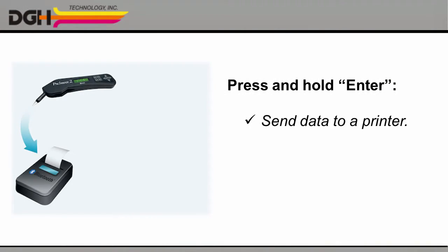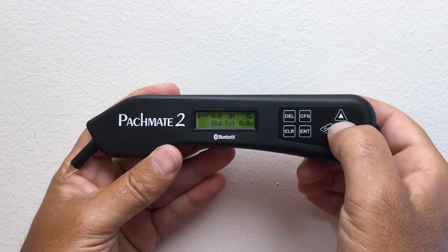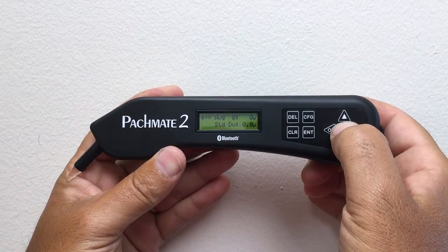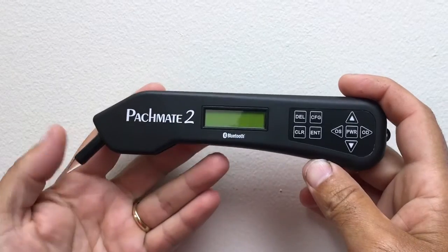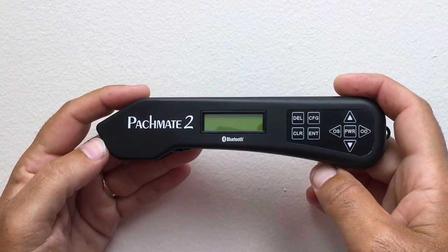Or press and hold the ENTER key to send your complete set of measurements to your printer or your PC over a Bluetooth connection. Please see the user manual for help pairing your Bluetooth devices. When you're finished, just press and hold the POWER button to turn the unit off, and then rotate the probe back into the body of the unit to keep the probe safe until your next biometry appointment.